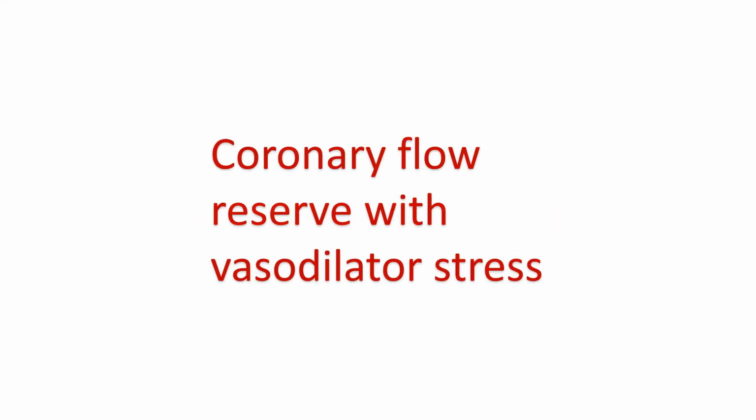Collateral flow can also be assessed during coronary occlusion prior to interventional procedures. The extent of collateral perfusion during coronary occlusion estimates the extent of viable myocardium. Vasodilator stress imaging is also feasible with MCE.